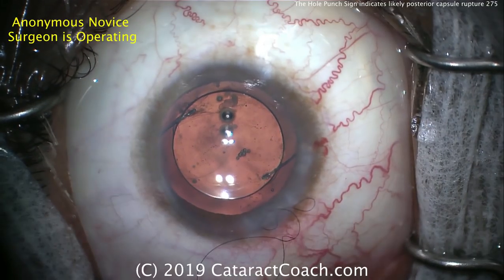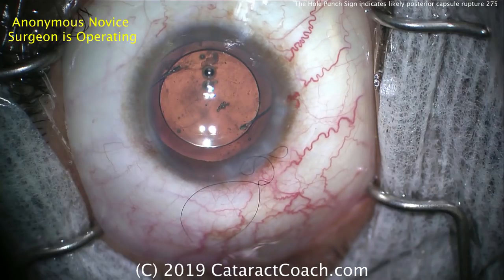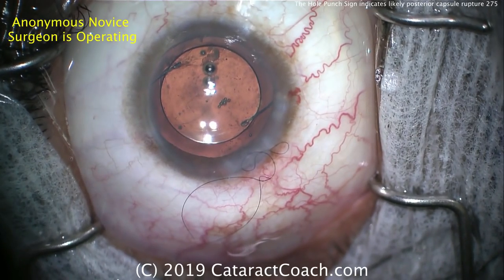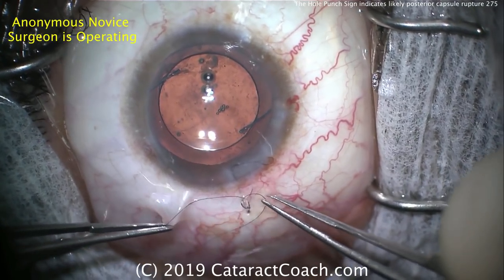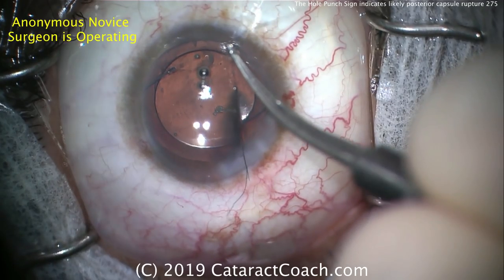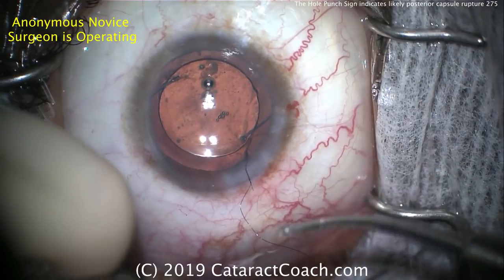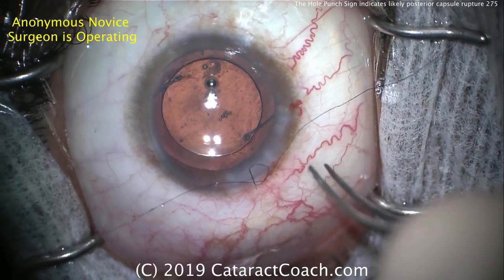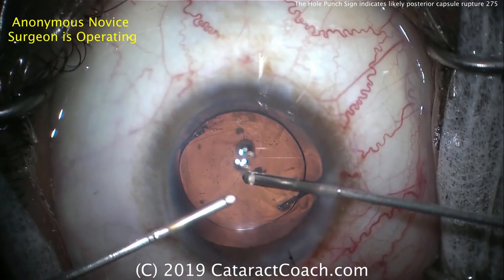That looks great. So important lessons learned here. The most important lesson is: if you see the hole punch sign in a piece of nucleus, that's an important warning that in all likelihood the posterior capsule was damaged. You punched a hole through the cataract piece and hit the posterior capsule. I like the idea of putting a suture in to seal incisions — if you've had a complication, in almost every case, put a suture in. It just makes your life a little bit less stressful. The most important lesson was the hole punch, and why did it happen? Insufficient separation of the four quadrants of the nucleus in the divide and conquer.